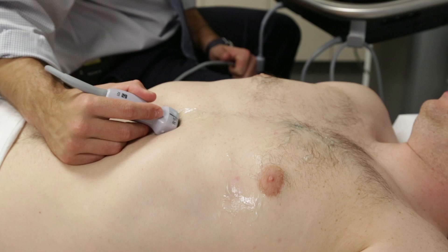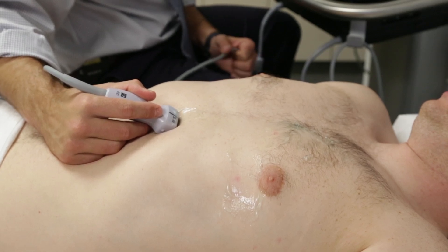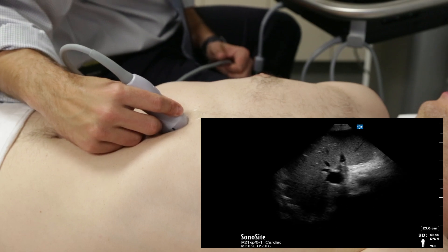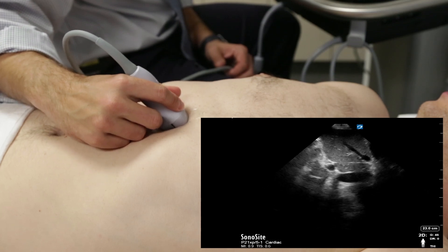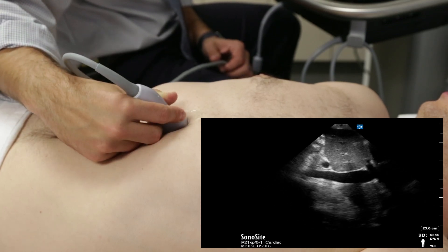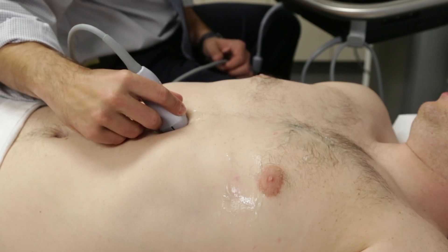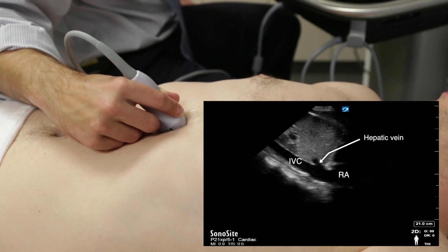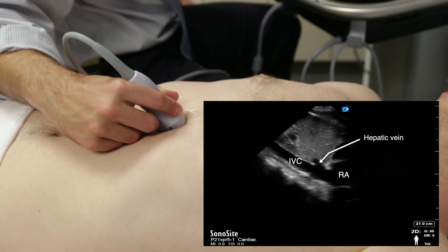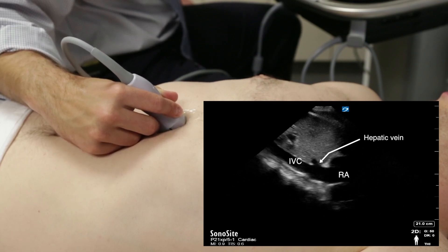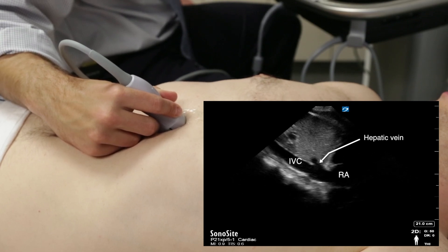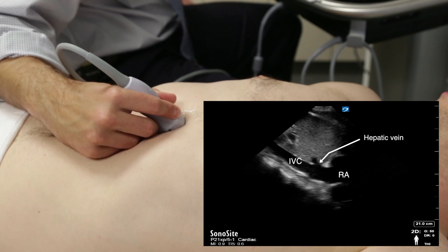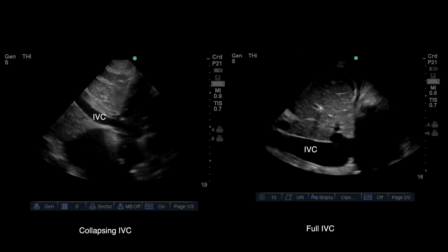We now move from the subcostal four-chamber view to the inferior vena cava view. This is an easy transition as we simply rotate the probe 90 degrees. The probe marker is now pointed cephalad. Holding the probe with a pencil grip, you may need to rock the probe slightly left to right to bring the IVC into view. A common error is to mistake the abdominal aorta for the IVC; this can be avoided by scanning along the vessel and visualizing it emptying into the right atrium. The aorta is pulsatile and has a wall that is thicker and more echogenic than the IVC. The primary benefit of the IVC view is to aid in assessing the patient's fluid responsiveness by using it as a surrogate for right atrial pressure.